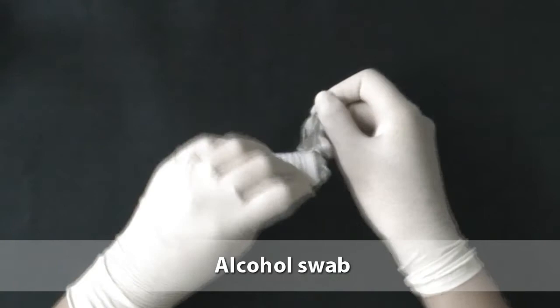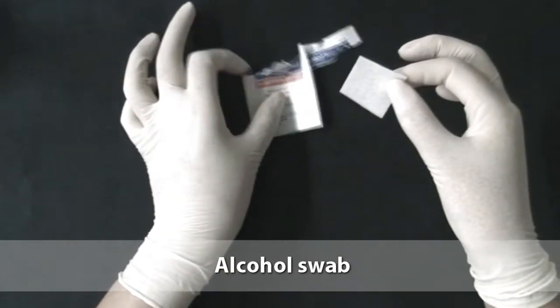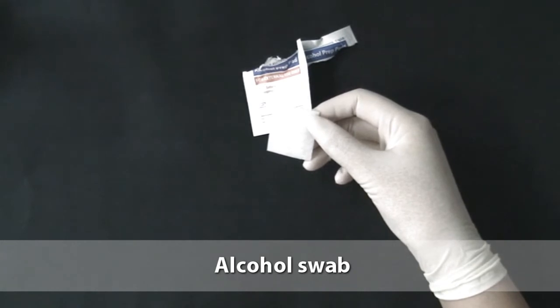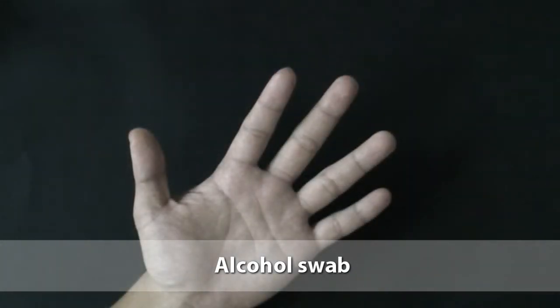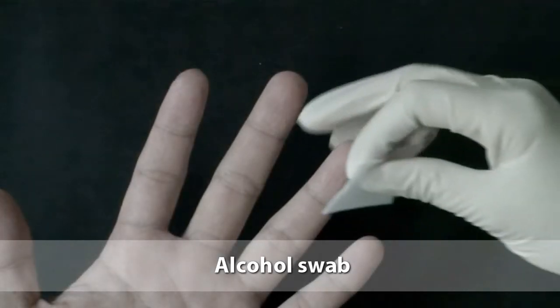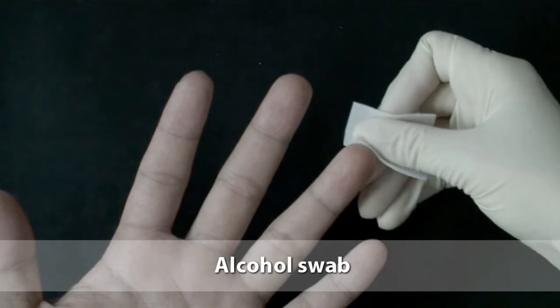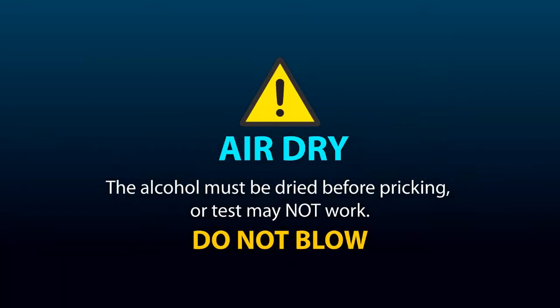Open the alcohol swab. Grasp the 4th finger of the test patient's hand. Clean the patient's finger with the alcohol swab thoroughly. After cleaning the finger, it must be allowed to air dry. Remember, the alcohol must be dried before pricking, or the test may not work. Do not blow or wipe the finger when you dry.